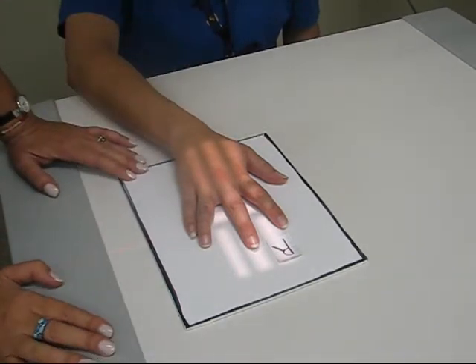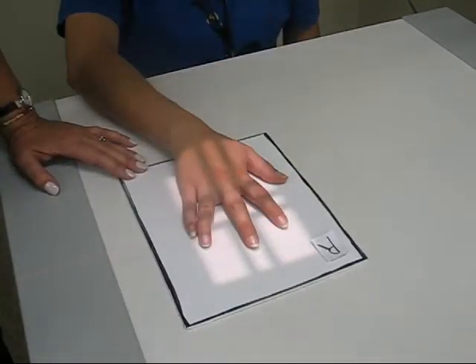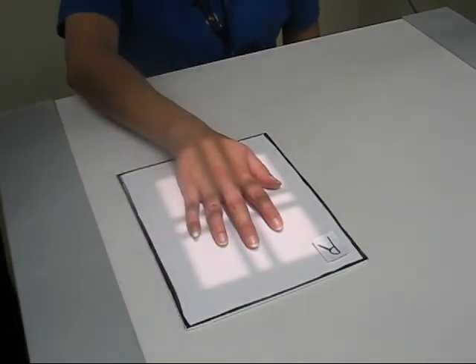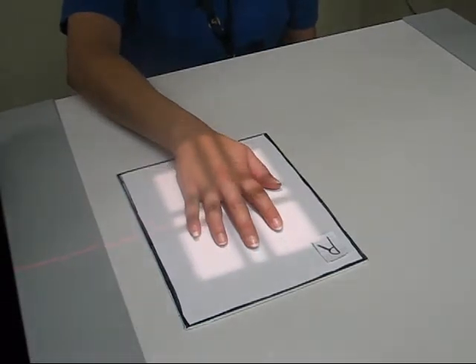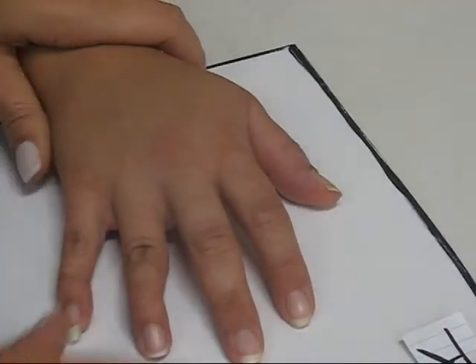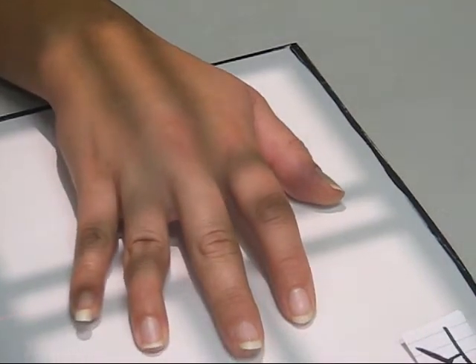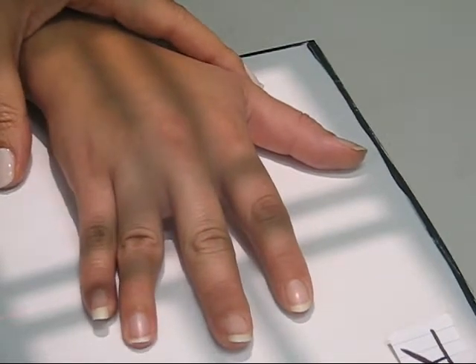If you wanted to do all the fingers, you would simply open your collimation to include all fingers, and you pretty much would be doing a PA of the hand, which is why in most cases when a finger is requested, we just end up doing the whole hand.